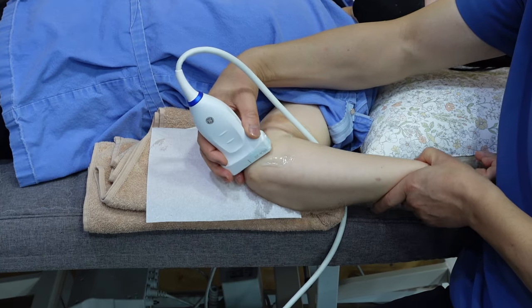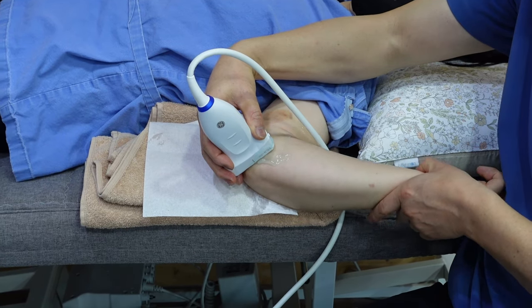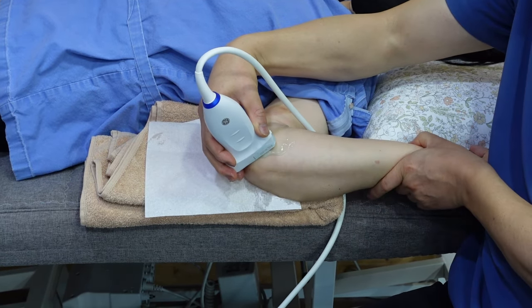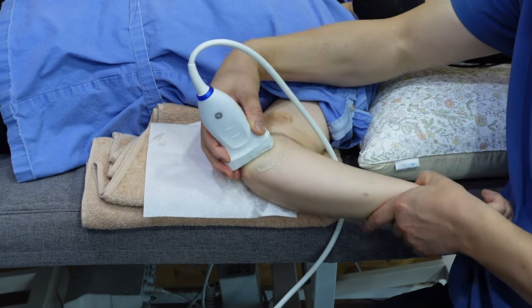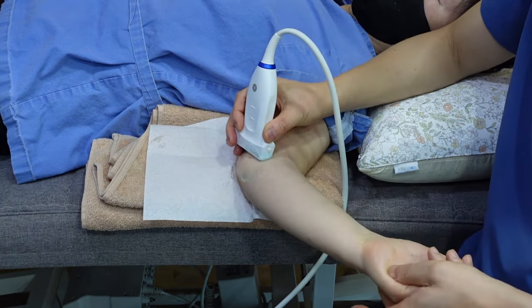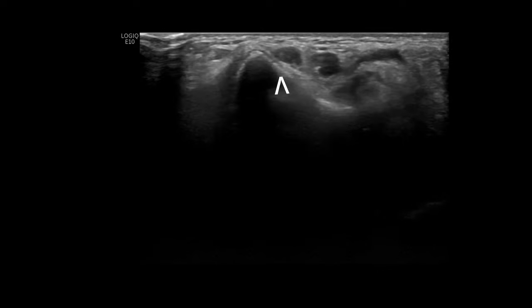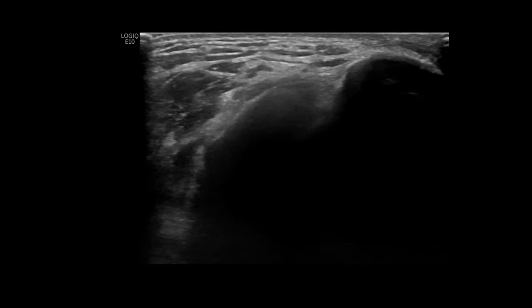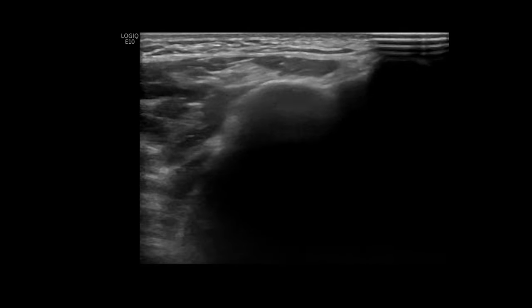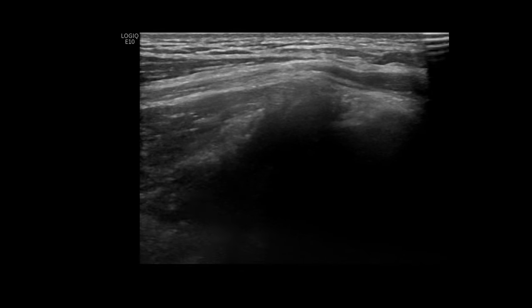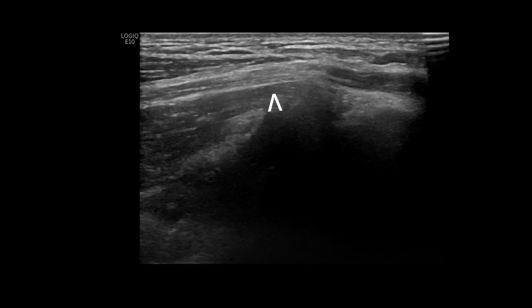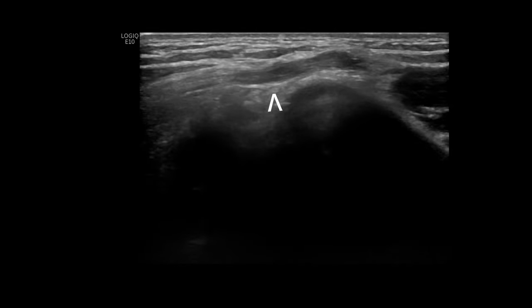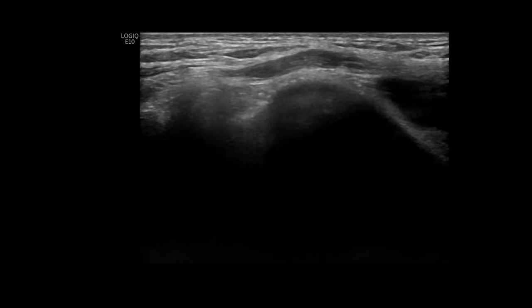For cubital tunnel evaluation, the patient is asked to rotate the forearm externally while keeping the shoulder fully abducted and externally rotated. The ulnar nerve is examined in its short axis from the distal arm through the distal forearm. It is important to carefully observe any changes in the nerve's dimensions as it passes through the epicondylar groove and the cubital tunnel.